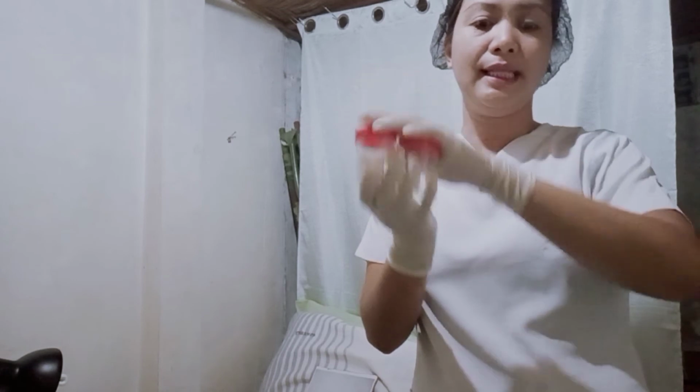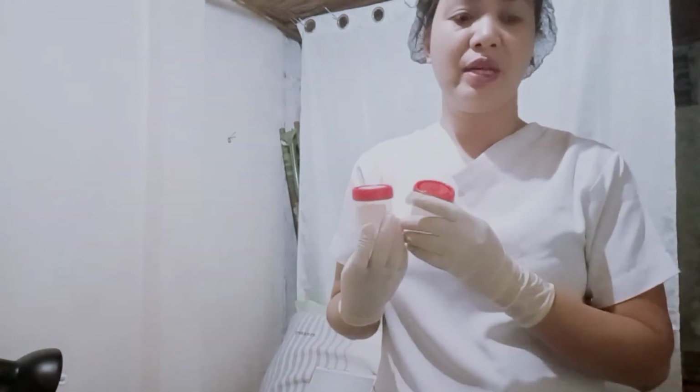Clean the bed of all equipment. Reposition the client for comfort and replace the linen for warmth and privacy. Raise the side rails. Measure the amount of urine in the collection container; this provides assessment data. Then gather all the additional equipment, discard gloves and perform hand hygiene. Hand hygiene deters the spread of microorganisms.